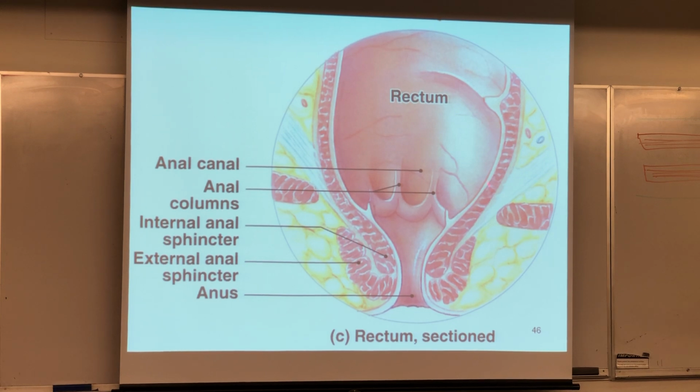This epithelium, since there's a lot of pressure there when you take the feces and try to push it out, I want lots of protection of underlying structures, so I better have stratified tissue there. I don't have to be stratified up here. I can be just columnar. I'm not worried about the pressure and the friction.